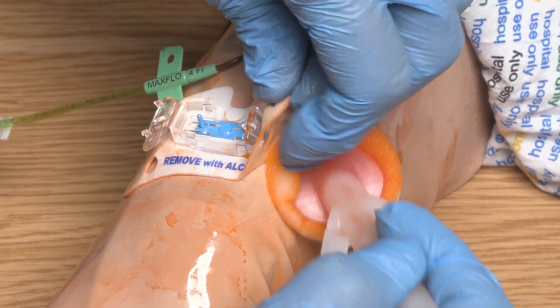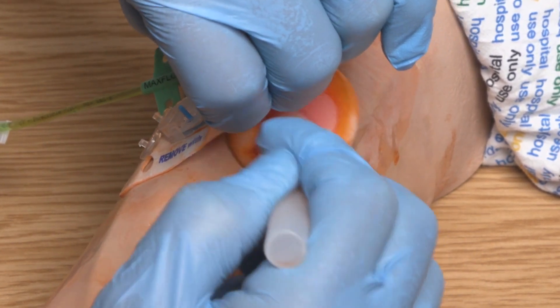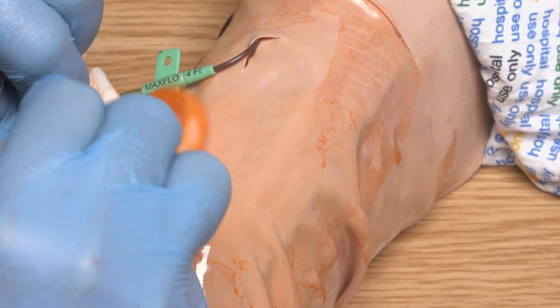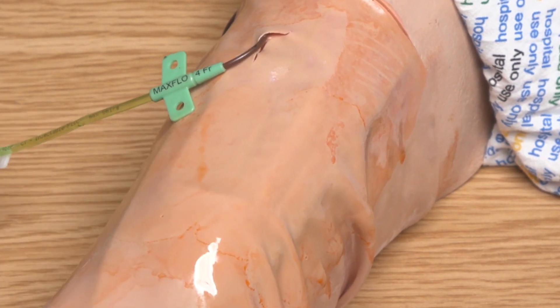I am now going to reuse my wand to encourage removal of the securing device by lifting a corner of the device and working the wand underneath it gently. The used wand should be disposed of immediately into a sharps bin as it contains a glass vial inside. Before I begin to redress the device I need to remove my PPE, perform hand hygiene and put on new PPE.